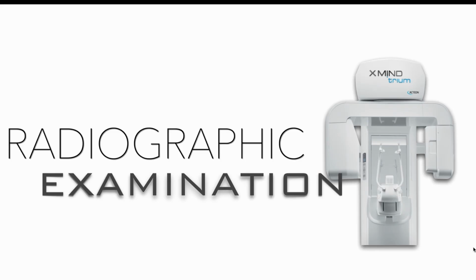About that, when you go with your treatment and you have all the data that you need before the surgery, it's always beneficial. When you have the 2D, the photos of the patient, the probing depths for all the teeth around, and your CBCT, it's beneficial.